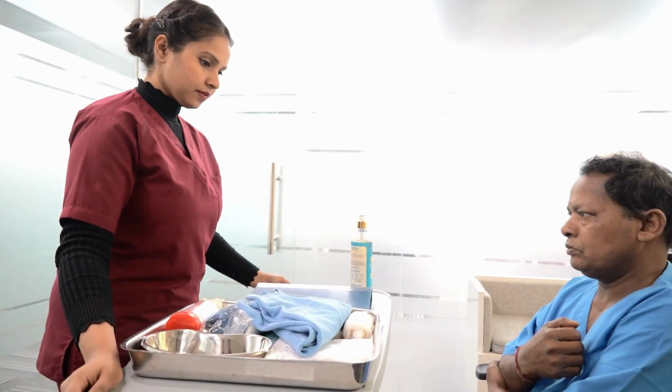Introduce yourself to the patient. Good morning, sir. This is Shilpa, your staff nurse from 8 a.m. to 2 p.m. Sir, may I know your name? Karthik. Okay, Mr. Karthik. Check the doctor's order sheet. Explain the procedure to the patient. Sir, as you have pain in your hand, now I am going to apply a sling.